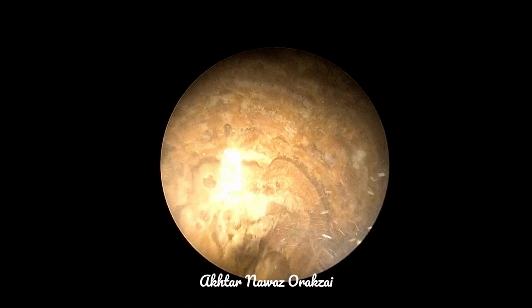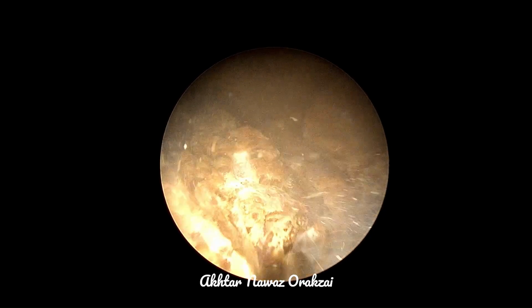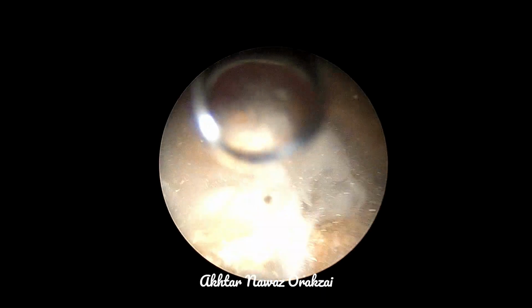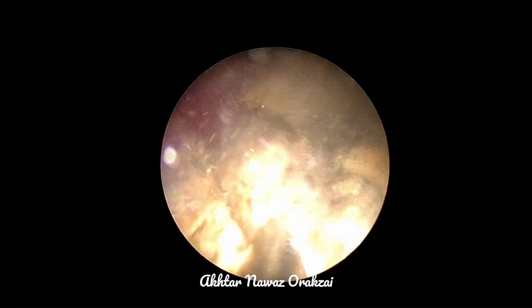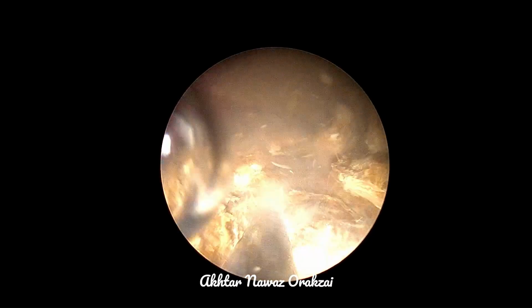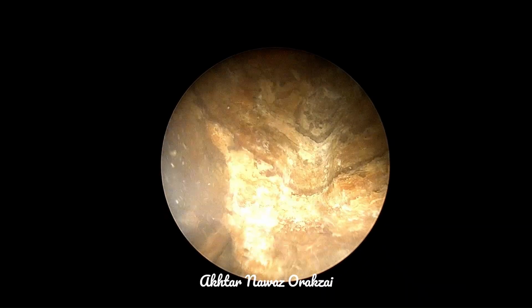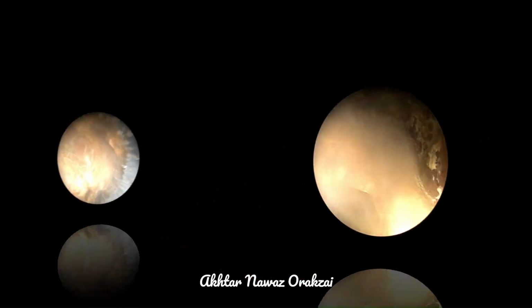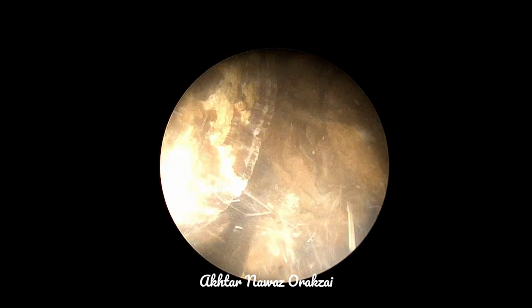But through the tract of the suprapubic region, and with the nephroscope, we saw that the bladder neck is quite high, which may be the cause for stone formation. Plus, the patient is not very mobile, leading to recurrent urinary tract infections and hence formation of the bladder stone. While fragmenting the stone, it seemed to be extremely hard, and it took a lot of time to fragment the stone. So not an easy stone to be fragmented.